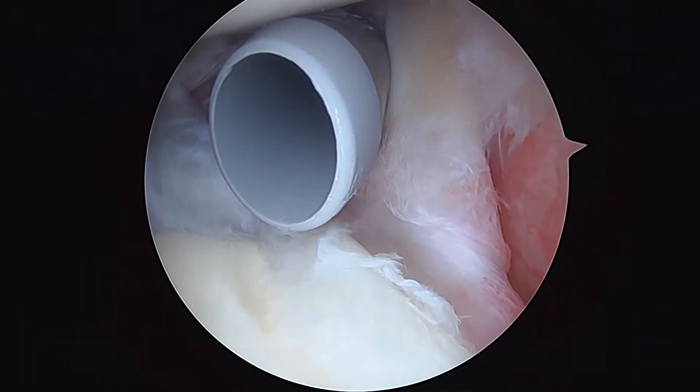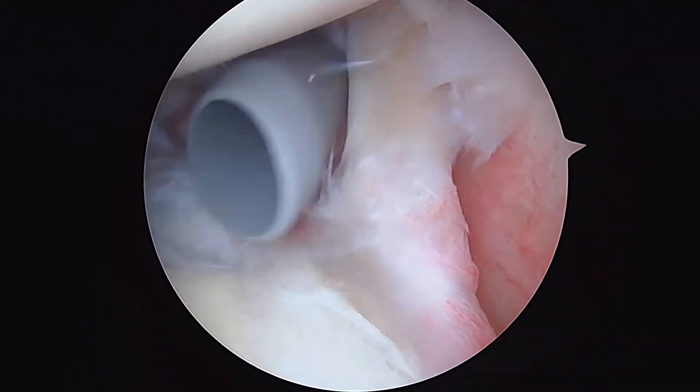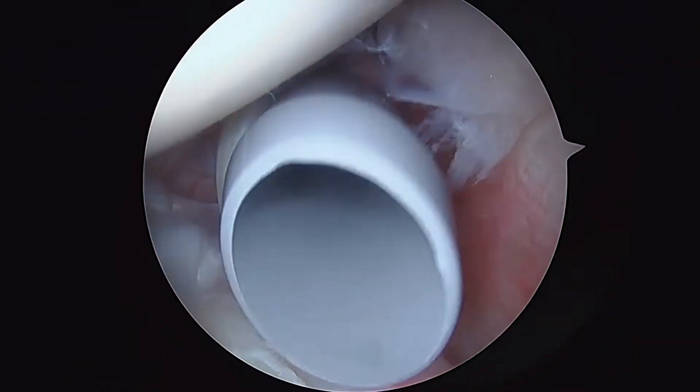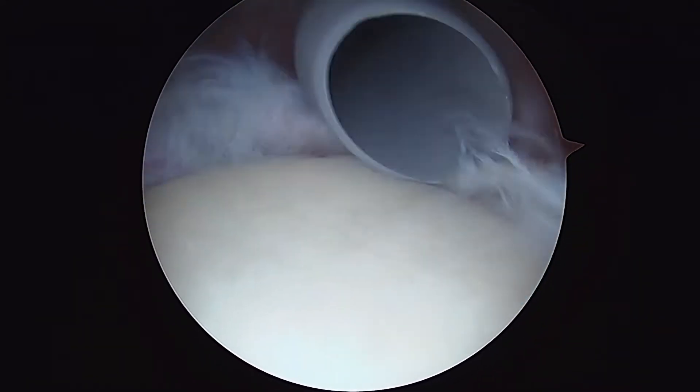We're just getting a start on the left shoulder, looking at it from the back to the front. Everything you see is magnified 30 or 40 times on the screen. To the right of that cannula, this is your biceps tendon. It doesn't look that bad, but the anchor's torn. See here how this is loose — that's a degenerative SLAP lesion.